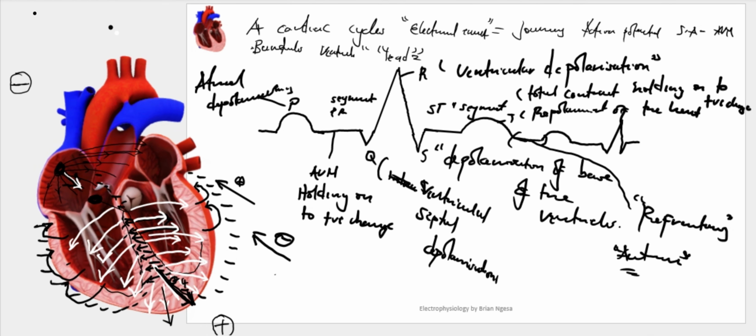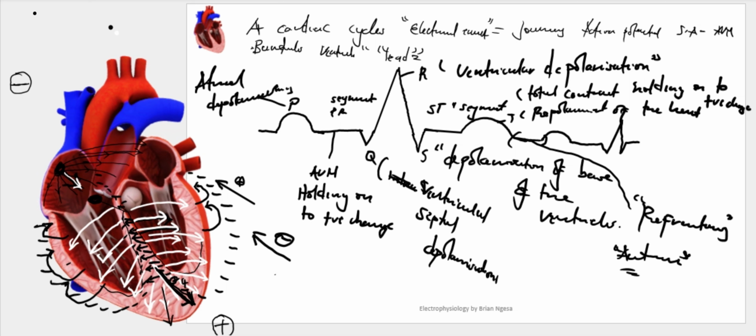So maybe what you can be able to notice is, in our part 3, we'll be able to explore, maybe we'll be able to jot the specific graph. How do you interpret a normal ECG? How are you able to determine the heart rate, the voltage, and also maybe you can go deeper and now try to see how various conditions of the heart might be able to change these waves.